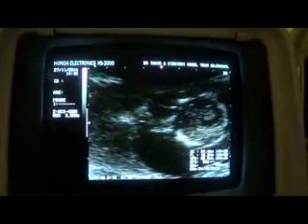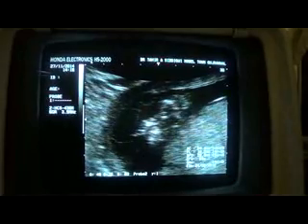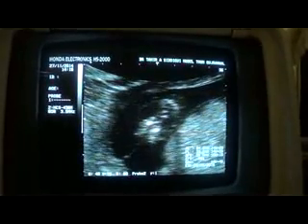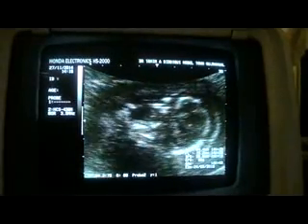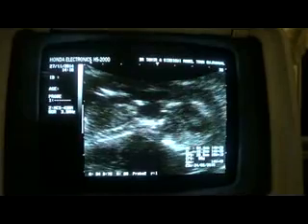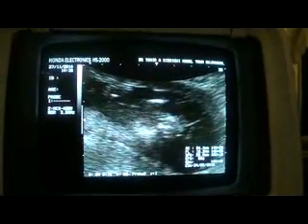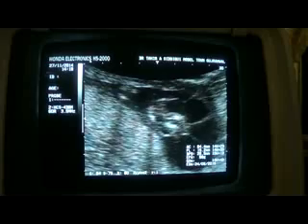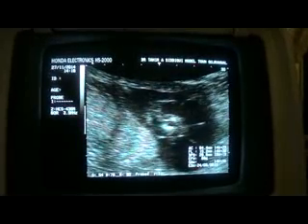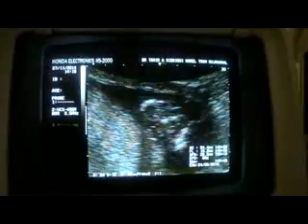And if I move the probe, give a sweep to the probe, it retains its shape. This does not disappear or change its shape. The cystic area remains there as it is. See, it is there. Now this is a 180-degree sweep, and you see that this cystic area persists. Keep an eye on this area.